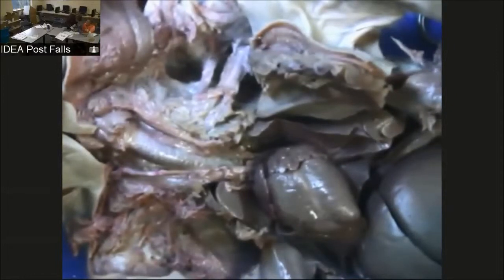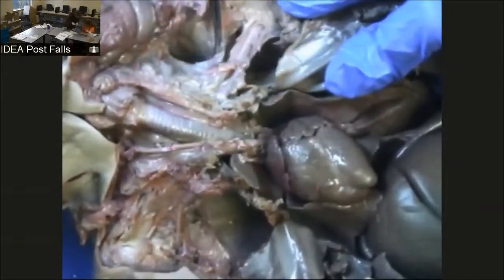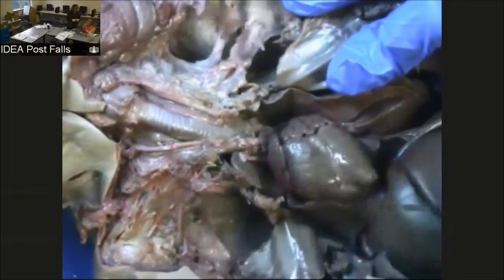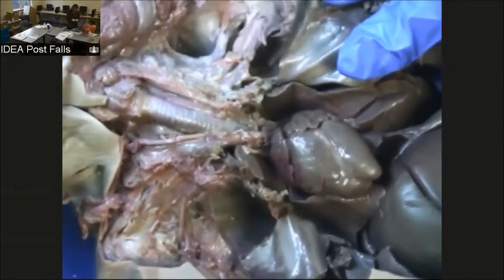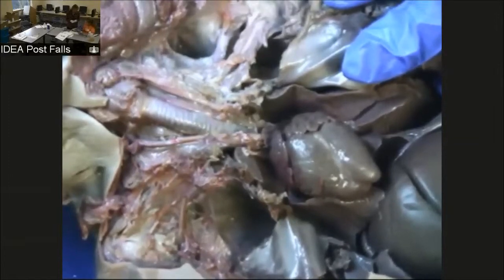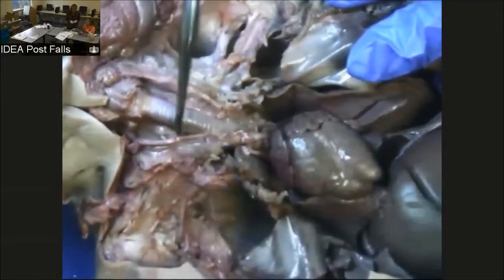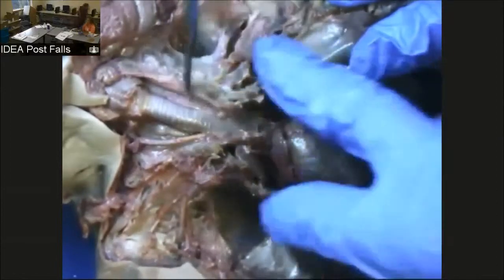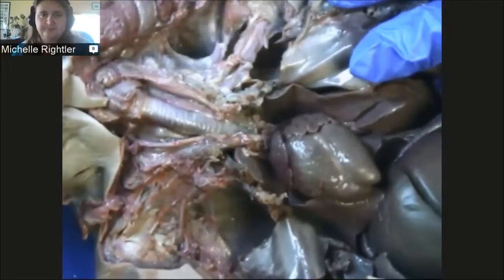So we want a little bit up. I see carotids pretty nicely — I see the carotids really nicely. You can do it in two minutes and be able to find everything. Are these things the carotids? No, no, no. Right next to the trachea. See the red? Then are these the subclavians? Yes.